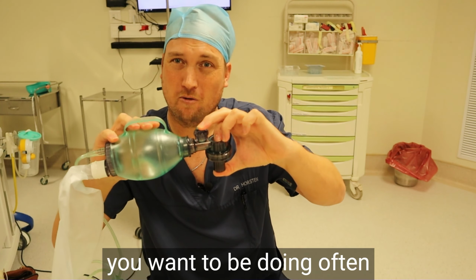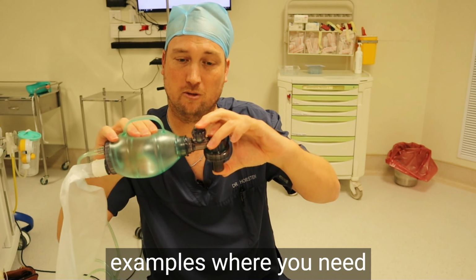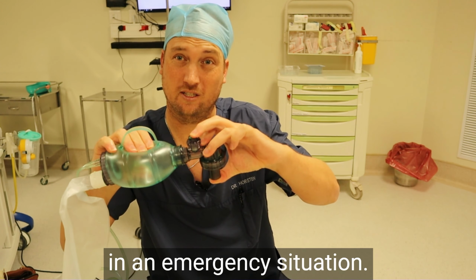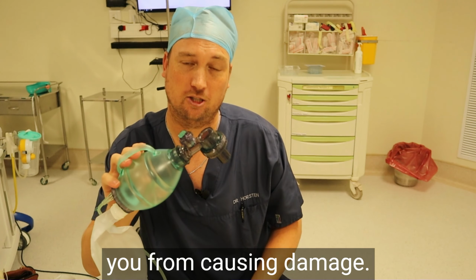That's not something you want to be doing often because you're going to be causing damage to the lungs. But there might be some rare examples where you need to occlude this pressure release valve so that you can generate higher pressures in an emergency situation. But for the most part, that valve is there to prevent you from causing damage.